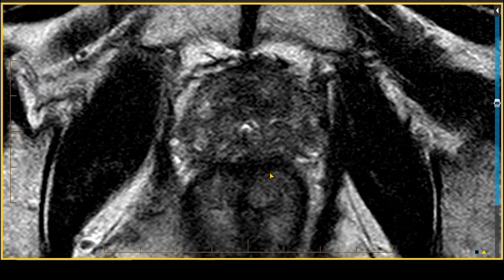Looking at the axial T2-weighted images, and remembering that in the transition zone the T2-weighted sequence is the king, you can see there is this area of moderate, homogeneous T2 shortening within the transition zone that is non-circumscribed, with very fuzzy margins.